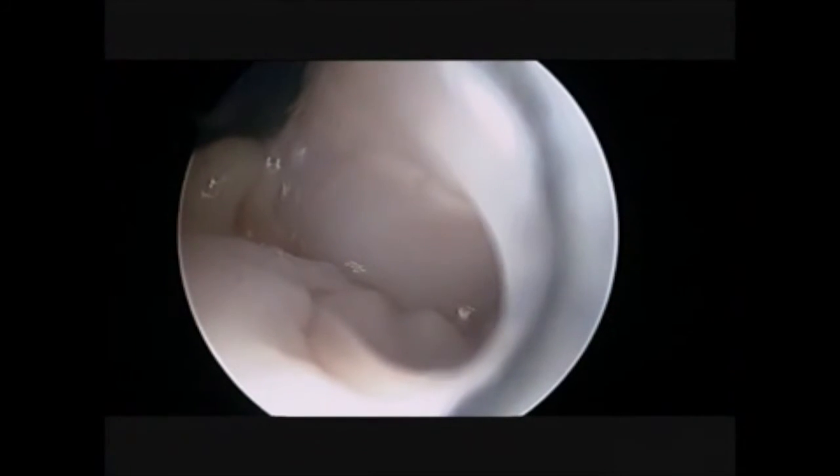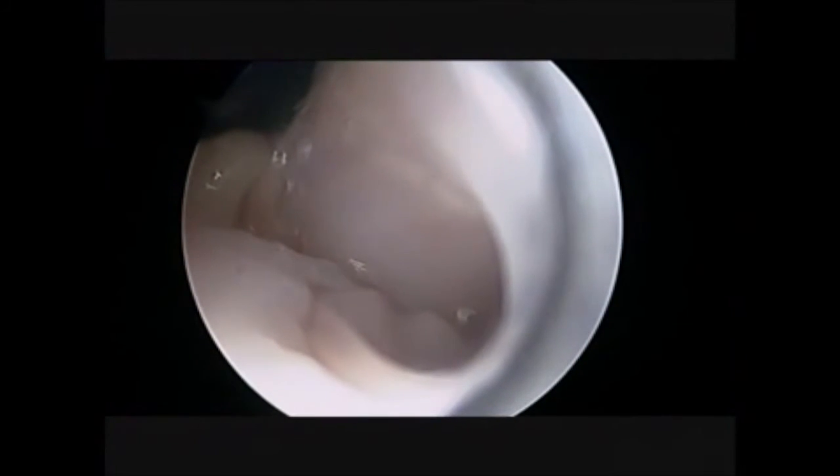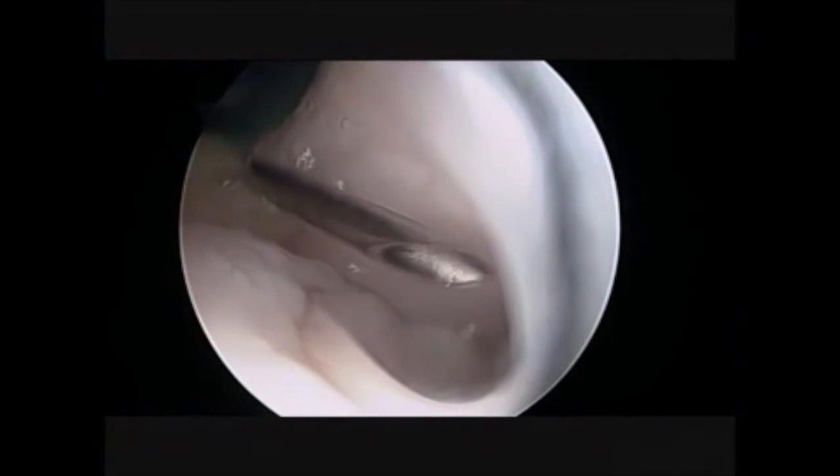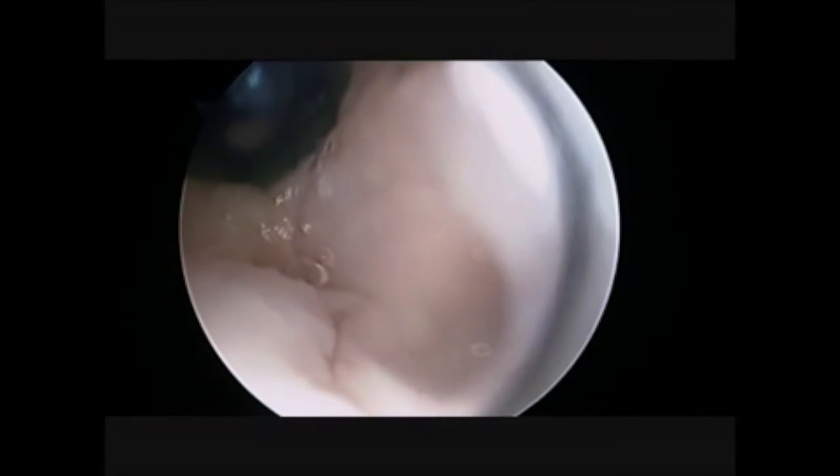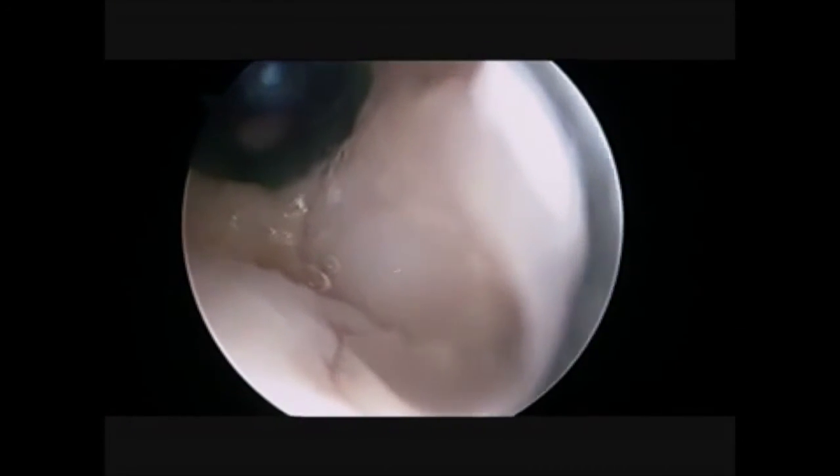Once the membrane is well seated and the anatomy is restored, we fix it with fibrin glue on the top. For technical and biological reasons, we prefer to use the fibrin glue only on the top of the lesion and not underneath, in order to allow the bone marrow stimulation to reach our membrane.